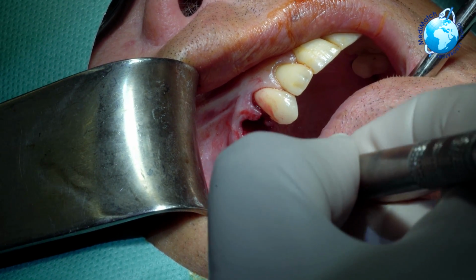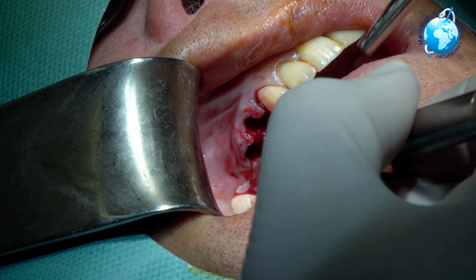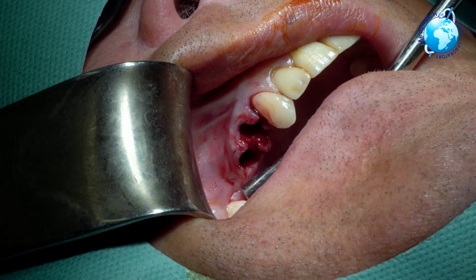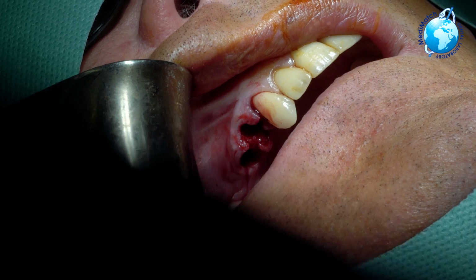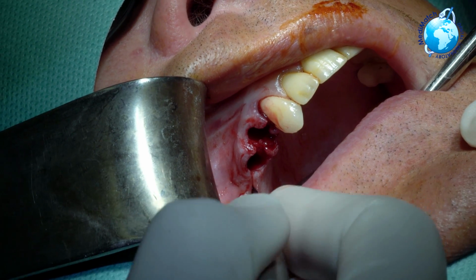I don't like the relieving too much yet until I feel how the tissues are actually going to come off and give me the view that I need. What I'm using now is the AD Blackline kit by a company called Titan. The kit was designed by myself. Very nice periosteal elevators.